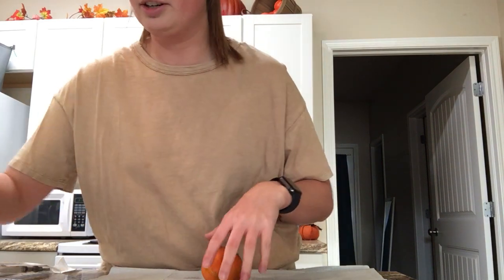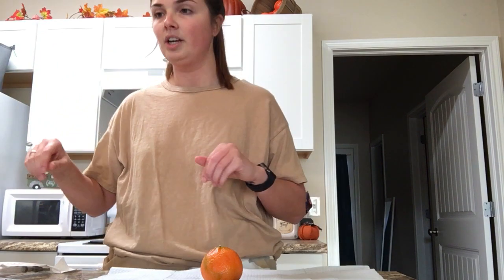And then, so again, now we're going to pretend it's after lunch. So now we're going to get ready to do our SUBQ injections. So I'm going to make sure I have everything. Okay, so again, we're going to do our rights of medication administration. So right med, right dose, right patient, right route, right time, and right documentation on the medication.